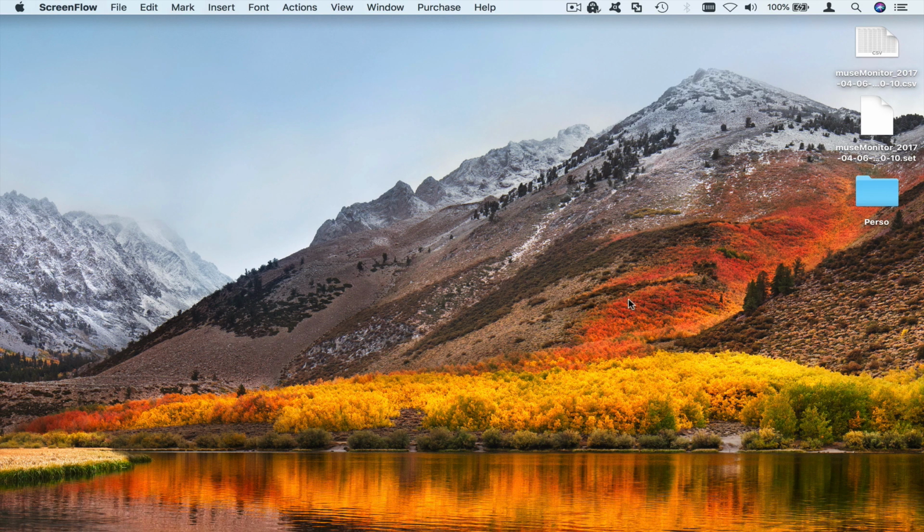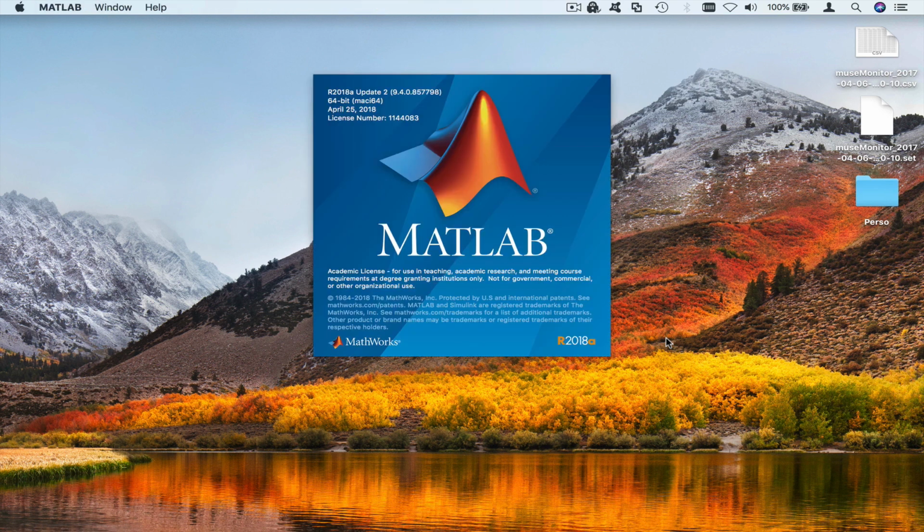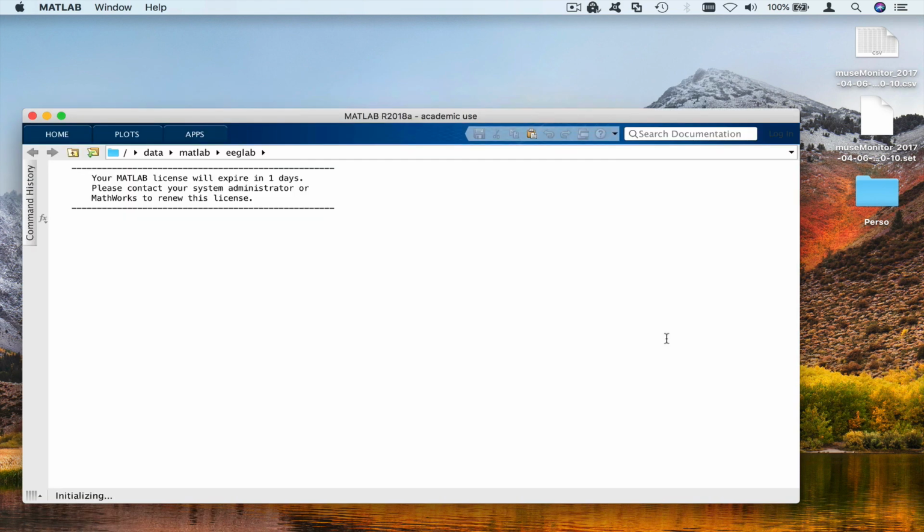So I'm going to show you how to process a Muse file. And first you start MATLAB. If you don't have MATLAB, it means you have a compiled version of EEGLAB. So if that's the case, you just double click on the icon and there is a video that shows you how to install this compiled version.